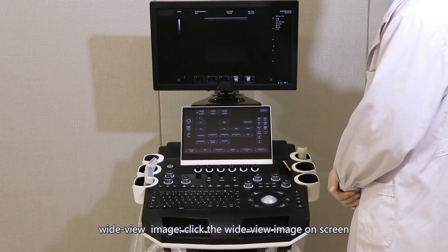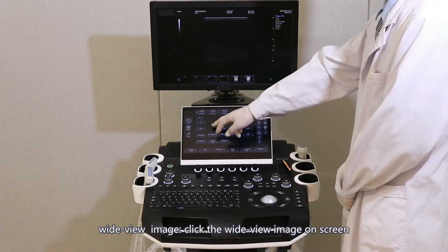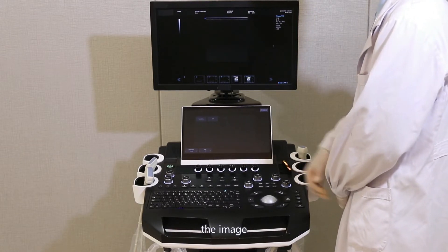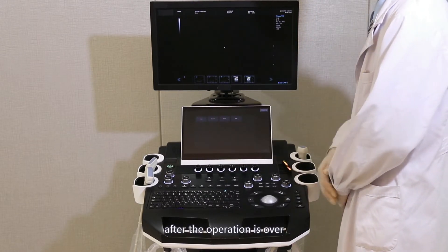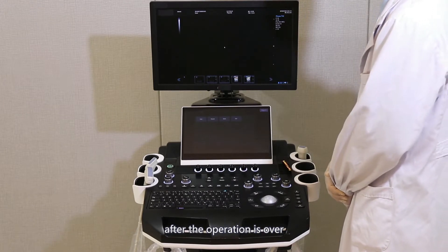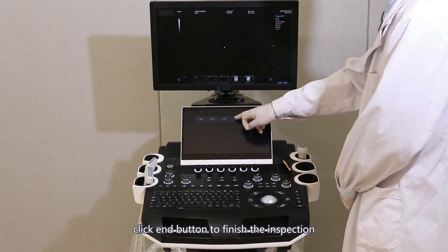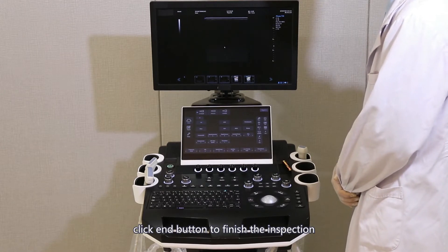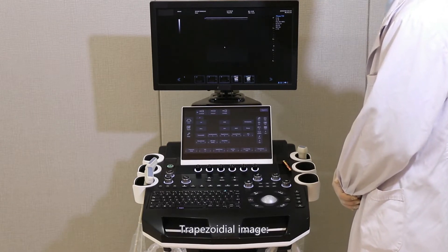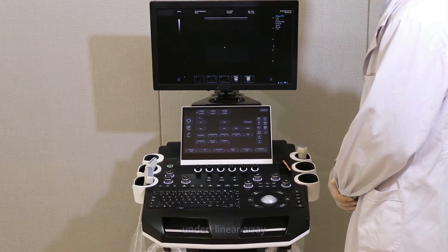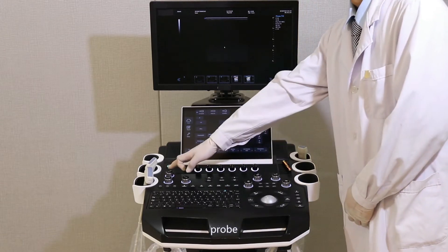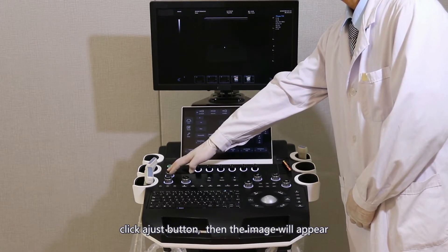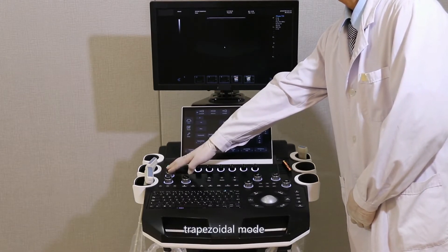Wide-view image: click the wide-view image on the touch screen to collect the image. After the operation is over, click the End button to finish the inspection. Trapezoidal image: under Linear Array Probe, click the Adjust button and the image will appear in trapezoidal mode.